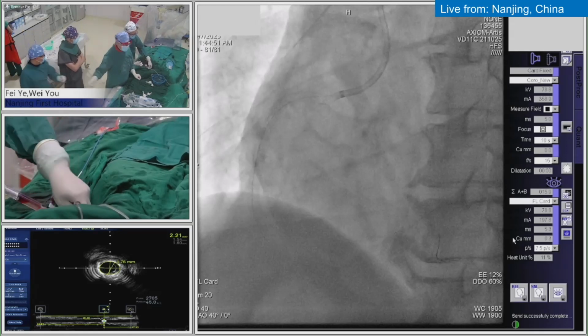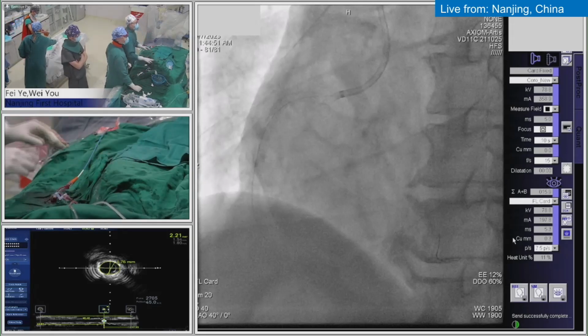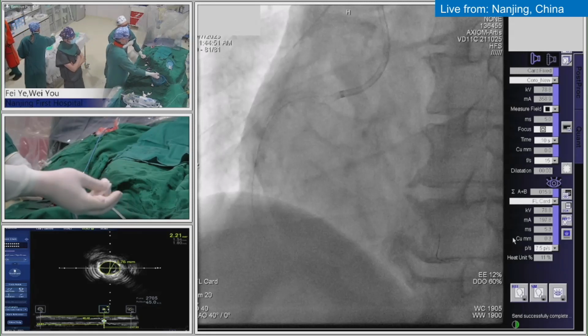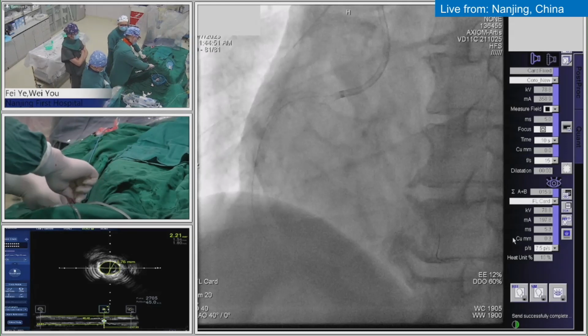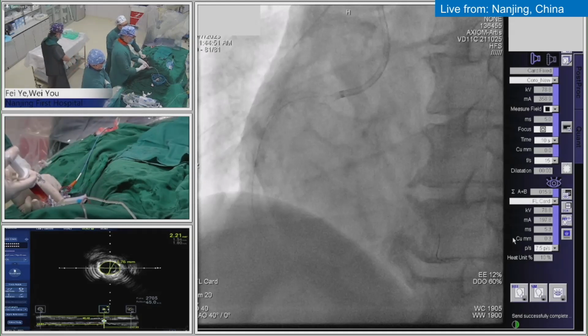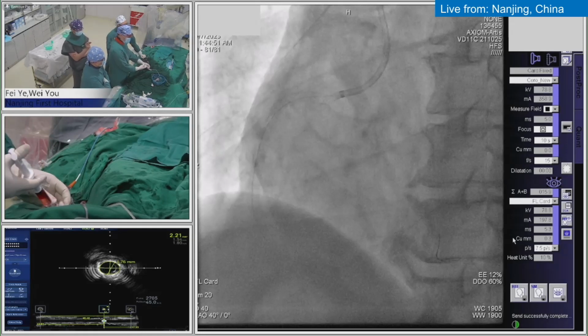Yeah, Chief. So before we had lithotripsy, the only choice we had for the severe calcified, especially for the big vessels, the reference more than 3.0, and the bigger size burr preparation, I think is the only choice. Yes, we think IVL is suitable for a very focal calcification.